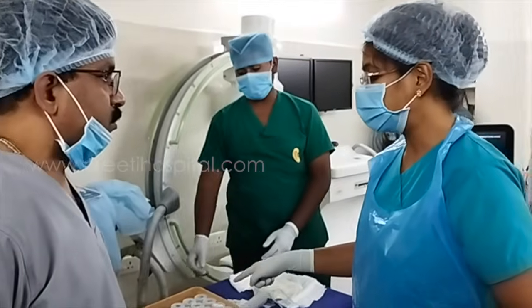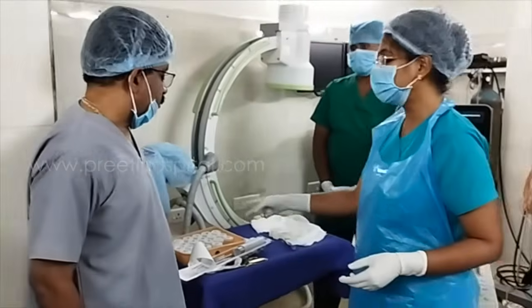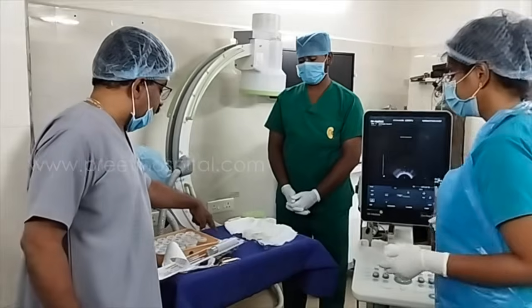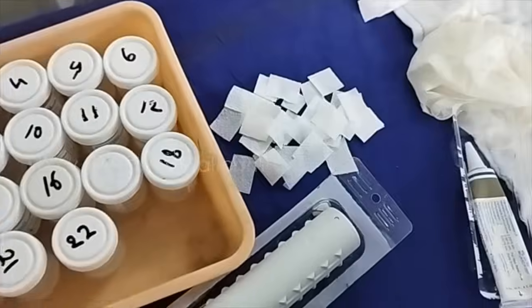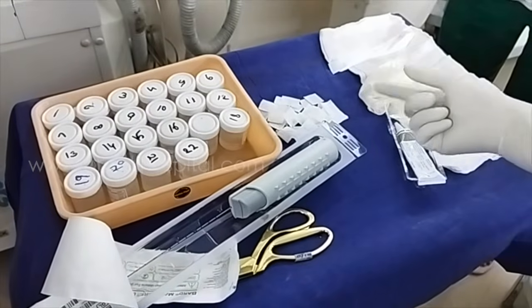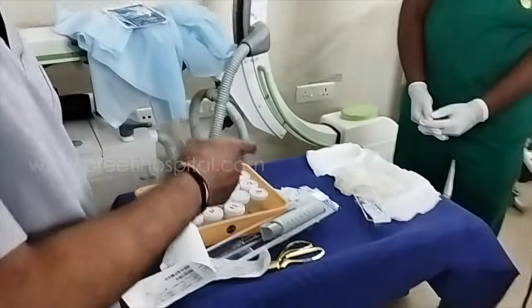This particular patient has already undergone a biopsy 6 months back, but it came out negative. So we are doing a saturation biopsy with 22 cores in view of rising PSA. What about these small things? These are tissue paper cut into small pieces so that while the needle is retrieved, we take out the tissue and see whether the length of the prostate core is adequate or not. After seeing, we drop it into the formalin bottle. It avoids the formalin touching the core.